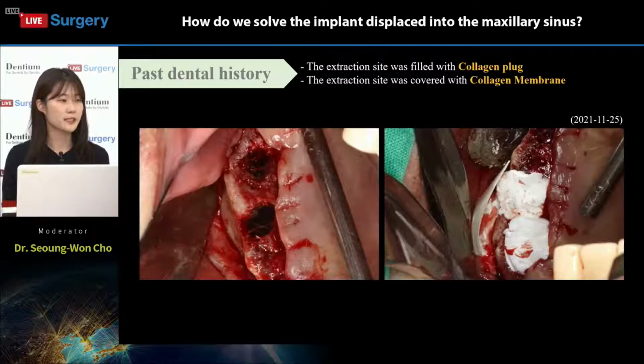After the removal, it is very important to facilitate the next steps to place the implants. There are two ways to choose. First, you can just remove the fixture. Or second, you can remove it and then carry out sinus augmentation and bone graft simultaneously. Today's live surgery shows the first case.